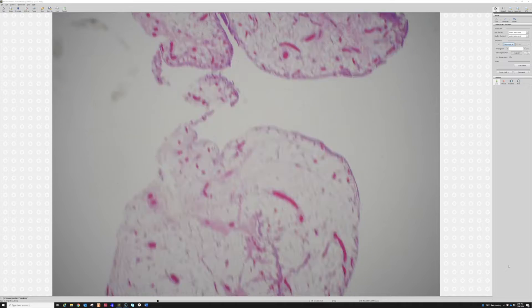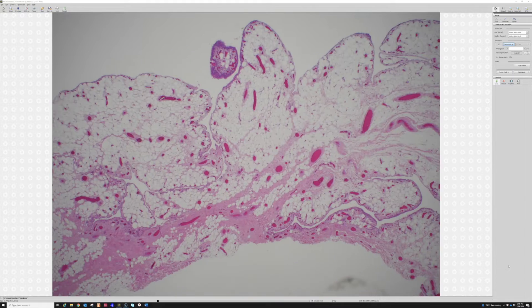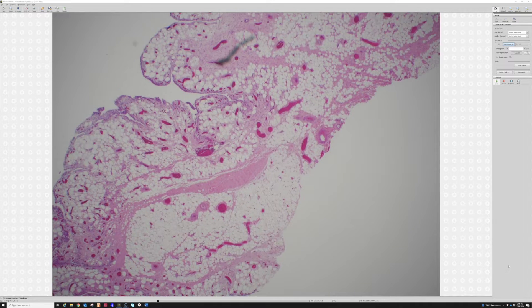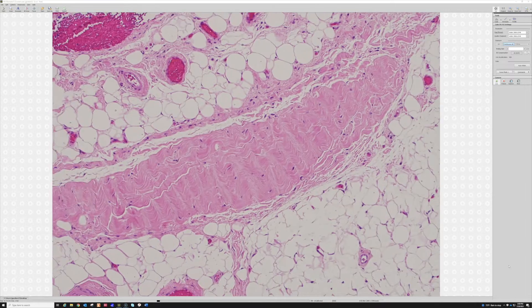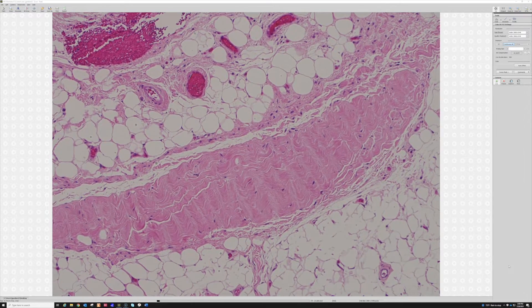I do have a scan of this somewhere — I'll have to pull that out and post it because it's so much more dramatic when you can see the entire lesion from low power. This is as low as 2x, as low as I can go. Wait — what's this structure right here? That's dense regular connective tissue, that's collagen, not nerve.